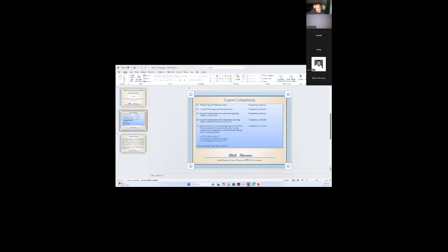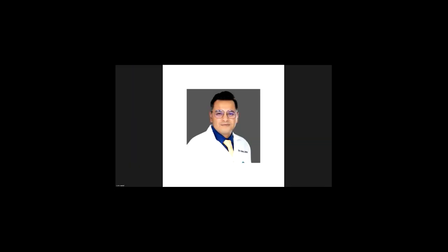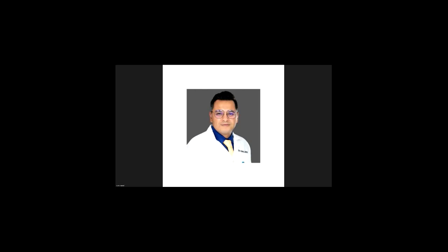Thank you, Dr. Al. Can I ask some questions? Yeah, please. I was reading through some didactic content. One doubt I had: how do you differentiate between periventricular hemorrhagic infarct and periventricular leukomalacia on a scan? So that's a good question.